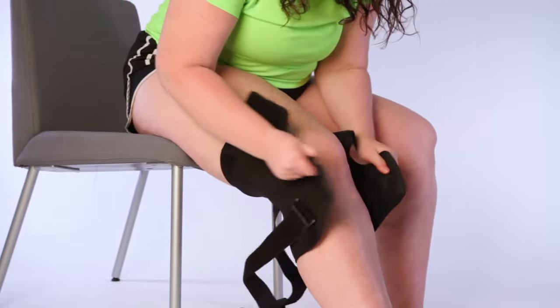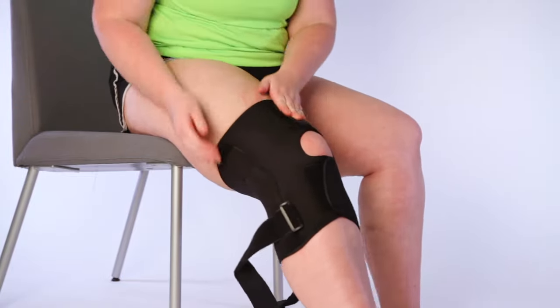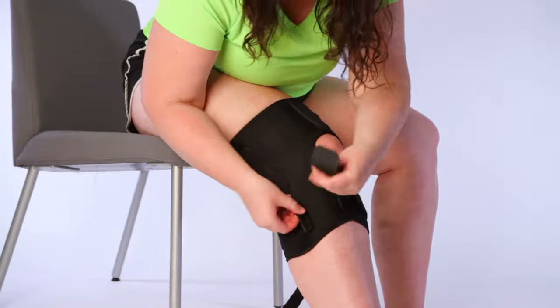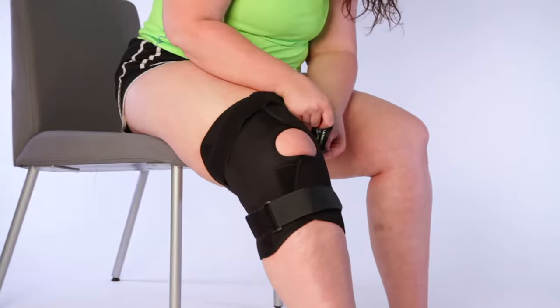Wrap the bottom portion snugly around your leg and secure the fastener. Repeat on the top portion, leaving the opening around your kneecap — that opening should be centered on top of your kneecap for maximum support. Wrap the bottom strap around your calf and feed it through the bottom D-ring, then repeat with the top strap.